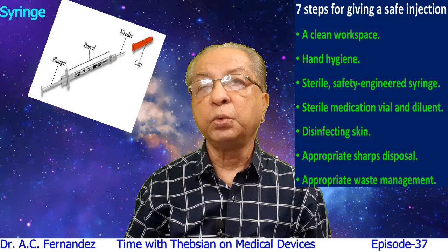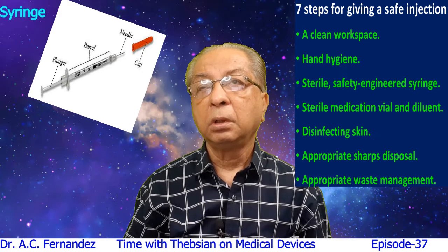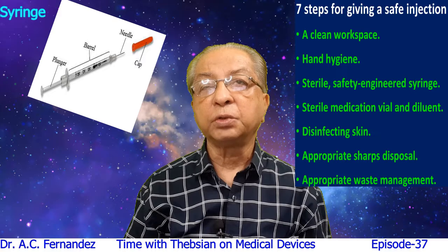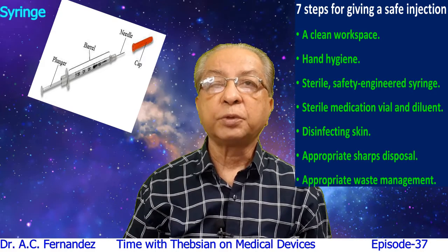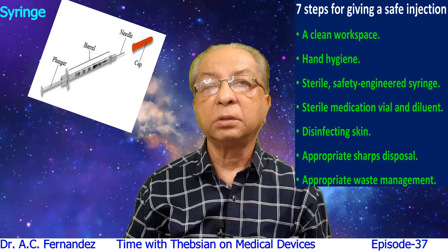Syringes should not be reused. Kindly do not reuse plastic syringes, and likewise the needles should be disposed of as per the standards of your health practitioner.